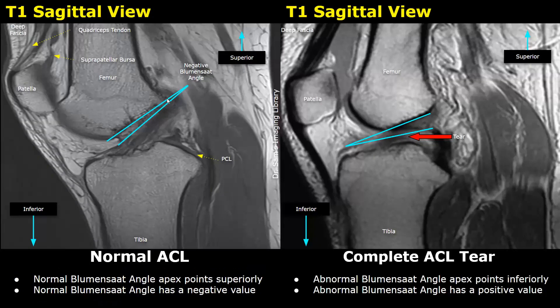In a normal case, when we draw these two lines they will always meet at this point, and the apex of the angle will point superiorly. In normal cases, these two lines will not meet down here — they will meet up here. The apex of the angle will face superiorly.